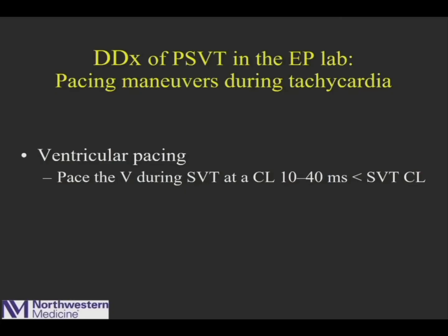All right, so what other things can you do when you're still not sure what the tachycardia diagnosis is? You can perform pacing maneuvers. The iconic pacing maneuver in the EP lab during SVT is introducing ventricular extra stimuli during tachycardia at varying coupling intervals. We refer to it as scanning diastole with premature ventricular beats.